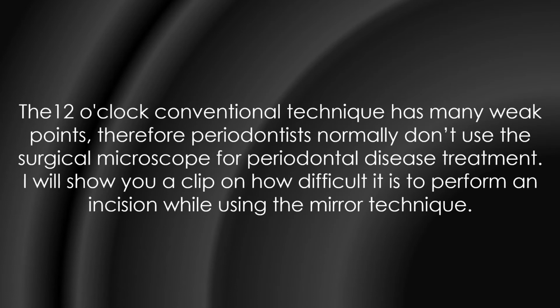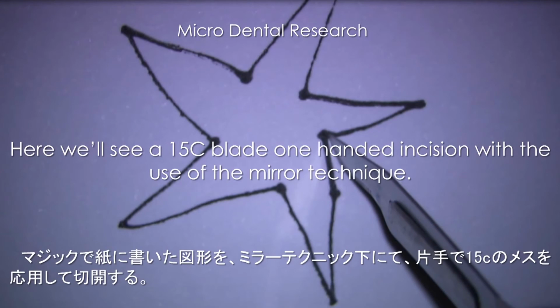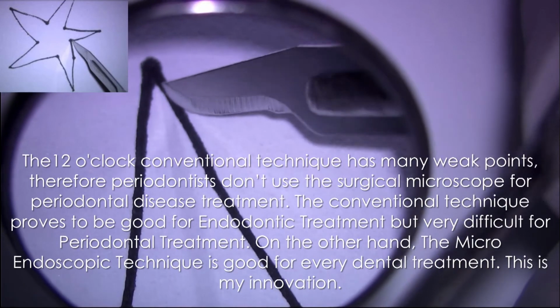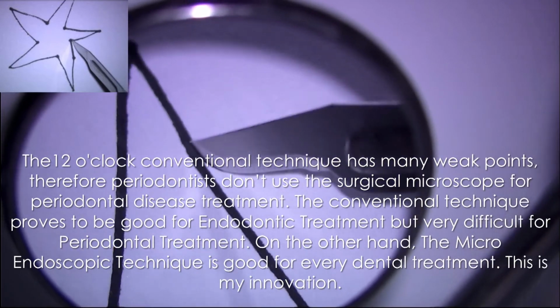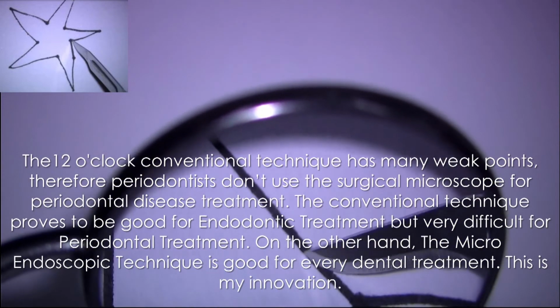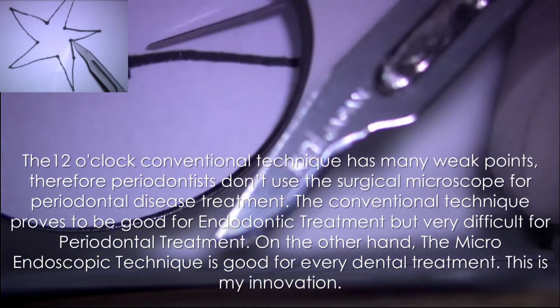I will show you a clip on how difficult it is to perform an incision while using a 15C blade, of course with one hand. Here you see a 15C blade one-handed incision with the use of the mirror technique. I will perform an incision on the left upper, but it is very difficult to recognize the shape because of the very narrow field of view.